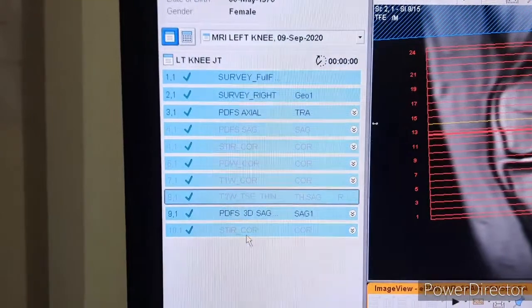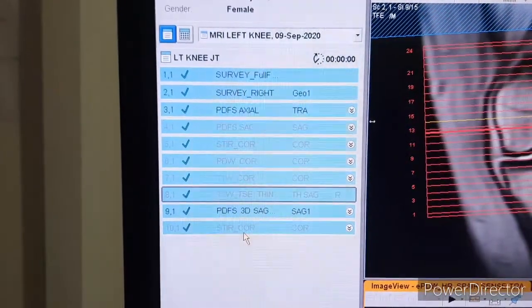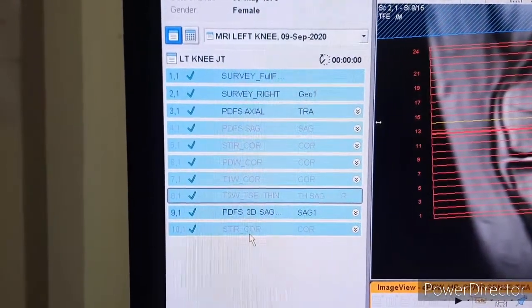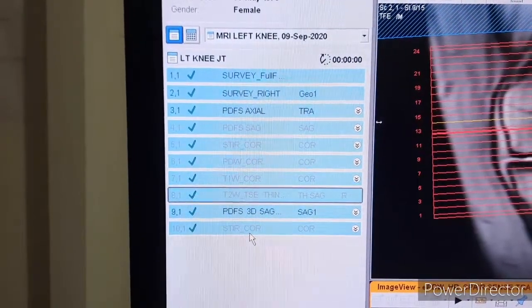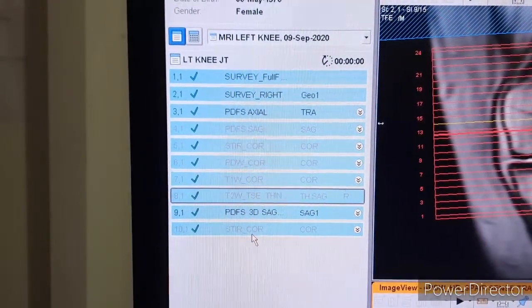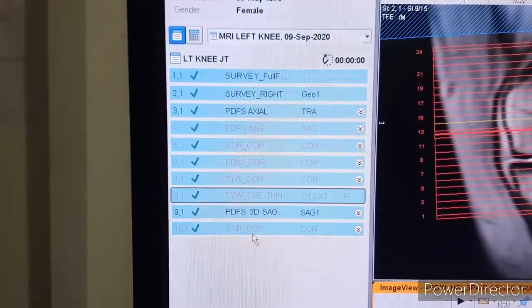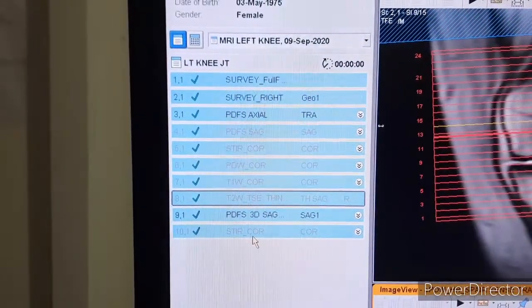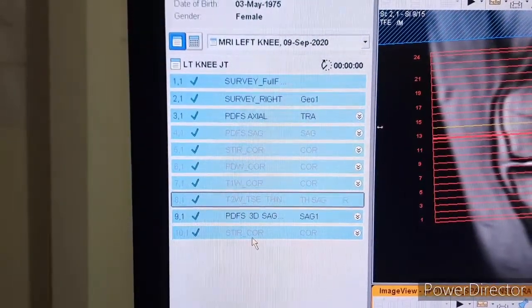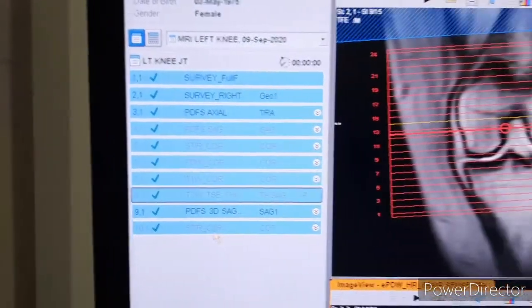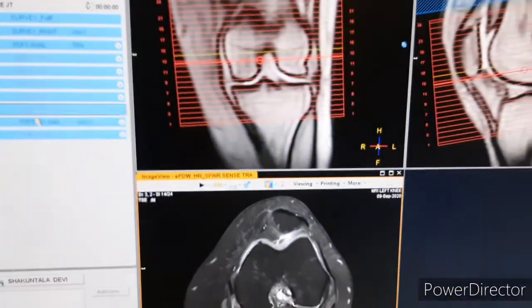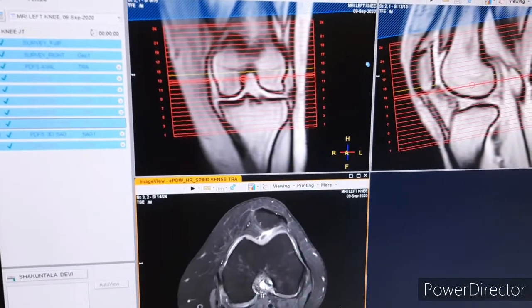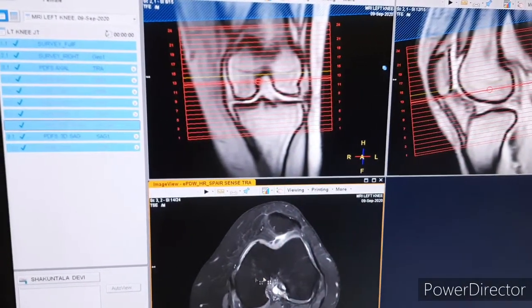Whenever you are giving this position, the knee should be internally rotated and fixed properly so the patient should not move during the scan. First we will see the planning of PDFS axial.